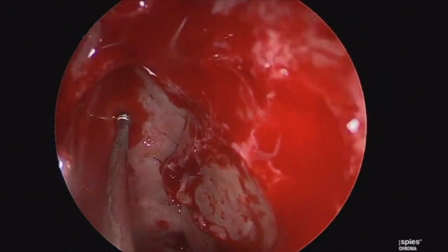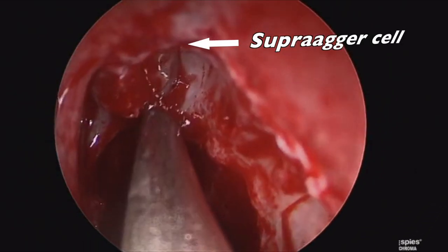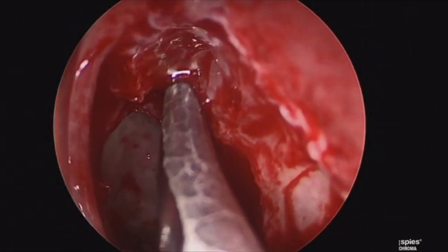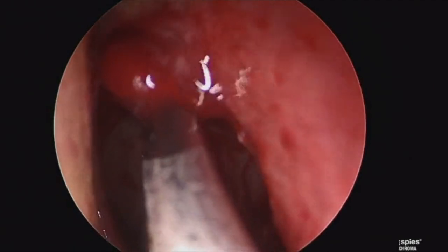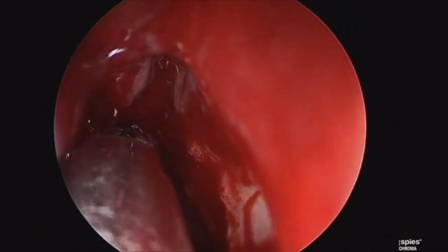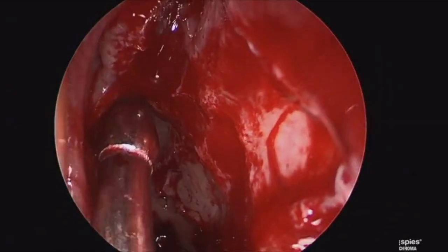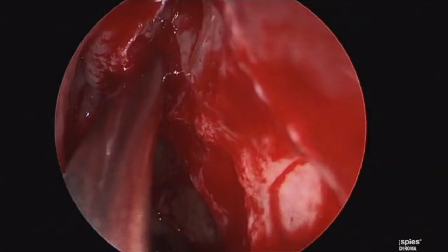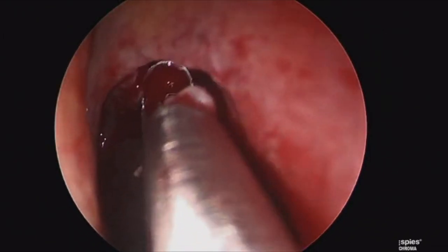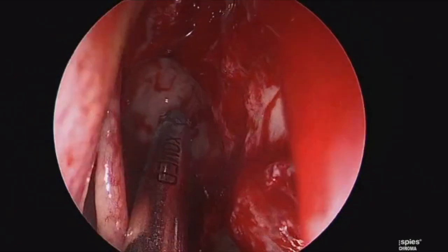At this juncture, we will turn our attention towards the patient's frontal sinus after all other sinuses have been completed. What you can see here is we're identifying that there is a suprabullar cell in the natural outflow tract — the frontal sinus is just behind that suprabullar cell. We're identifying that with the assistance of computer navigation. We'll then come in with the frontal sinus curette into that natural outflow tract and begin to collapse that suprabullar cell forward and widely expand that frontal sinus outflow tract. We've taken on some more of the axilla in order to maximize access to this area, and there is that polypoid opening into the true frontal outflow tract. We're coming in with a pediatric frontal curette to remove the last portion of that suprabullar cell and expand that axilla a little bit more to maximize visualization and access.